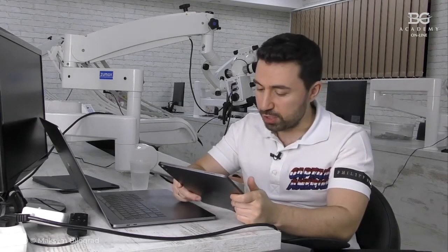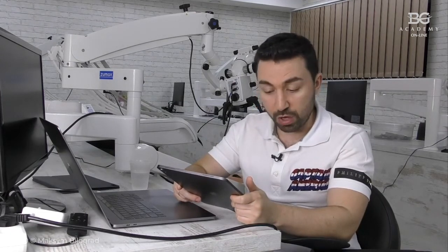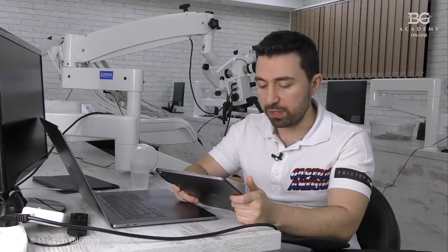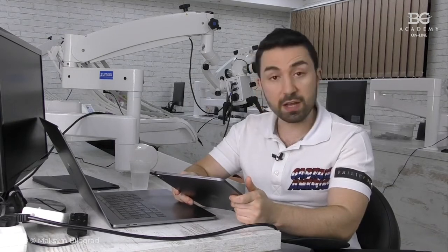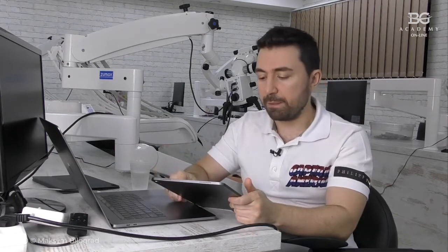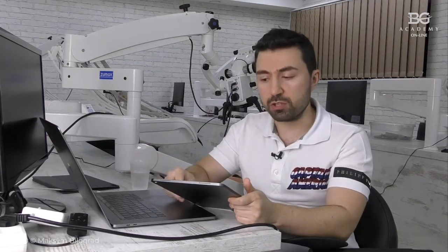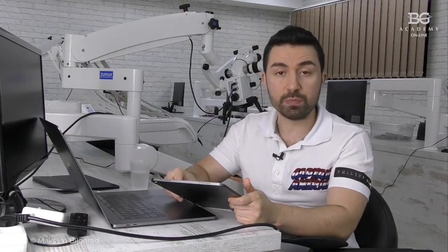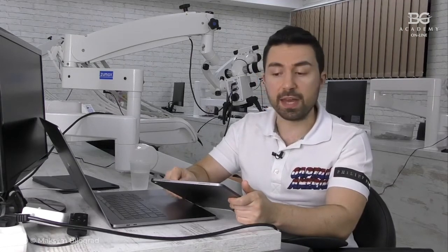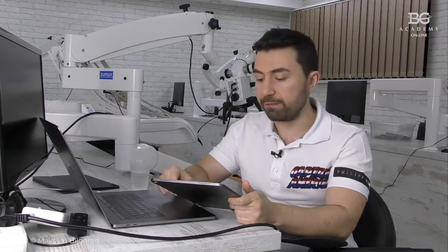I have two questions. What to do if we accidentally removed too much tooth structure? And the second question is, will you have an inlay, onlay, overlay video, please? Thank you. So, my friend, if you remove too much tooth structure, unfortunately, sometimes it happens, and you expose too much dentin, I prefer to go for the IDS procedure, that will give me less postoperative sensitivity. And also, it's proved scientifically and clinically that IDS gives you better bonding to porcelain veneer.